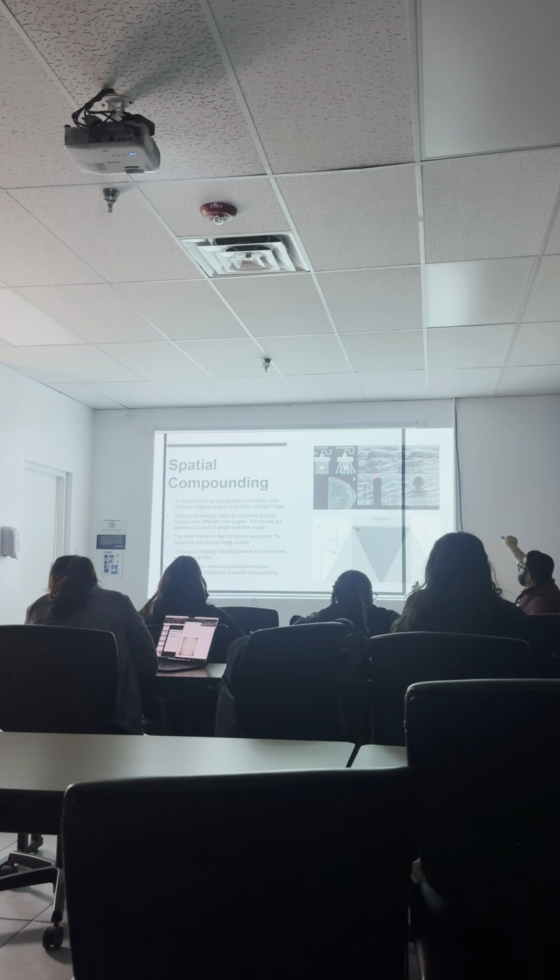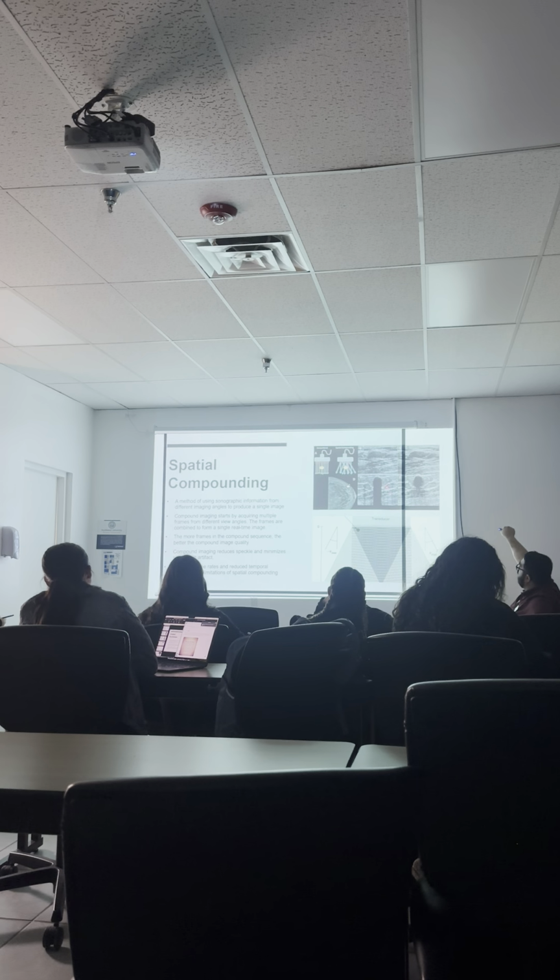So if you notice here, the beams are just going in a parallel direction, right? Okay, but this image right here is sending the beams to the right, to the left, and to the center. And what did it do? It showed us the tissue behind the cyst, or behind the vessel, right?